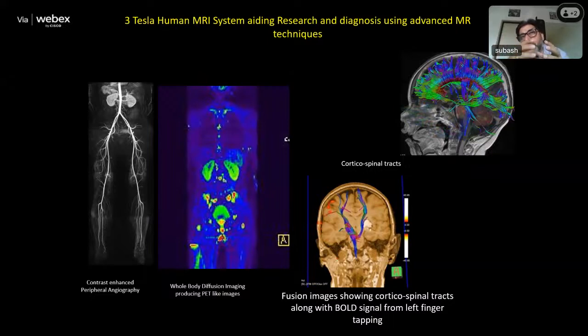You can play them in cine mode and see how the left ventricle and the heart are pumping blood, how much blood is pumping, what the ejection fraction is, what the left ventricle volume is, and in the systolic and diastolic phases what the amount of blood and the volume of the ventricles are. All this can be calculated by having a proper orientation of these images, which can be very, very easily done by MRI.